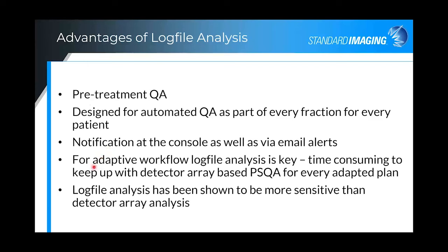And for the adaptive workflow, log file analysis is key because it's time consuming keeping up with detector array-based PSQA for every adapted plan. But it's got great utility for non-adaptive workflows as well, for patient safety aspects. On the Clinac, log file analysis has been shown to be more sensitive than detector array analysis.